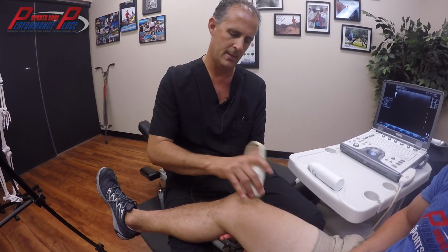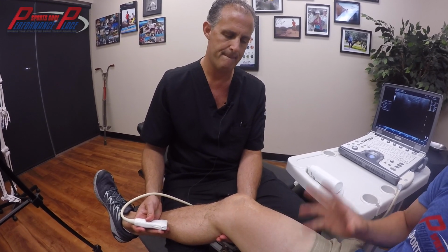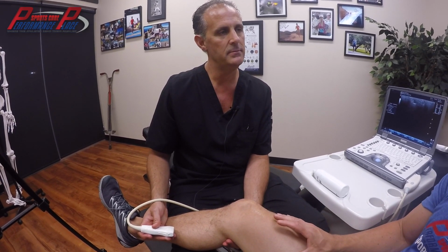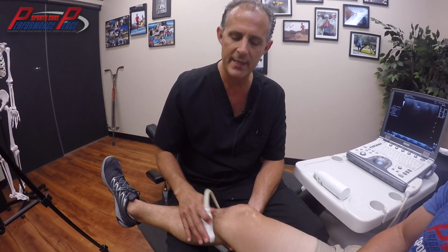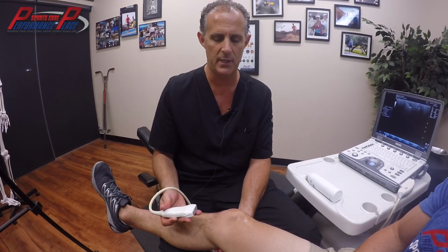So with everything you looked at already, since patients will probably want to know, is there a need for an x-ray in this case that we have here? And is there a need for an MRI, and what are we looking for in those versus what we just saw? Okay, now x-ray is x-ray, and in many places they go right to x-ray, because x-ray gives a good overall view of the joint.